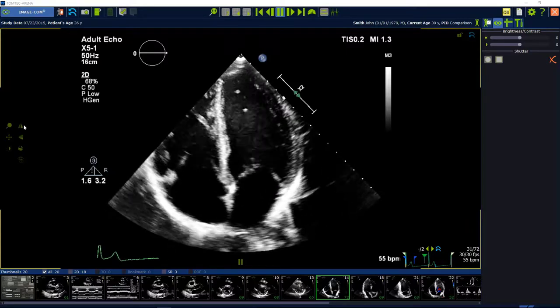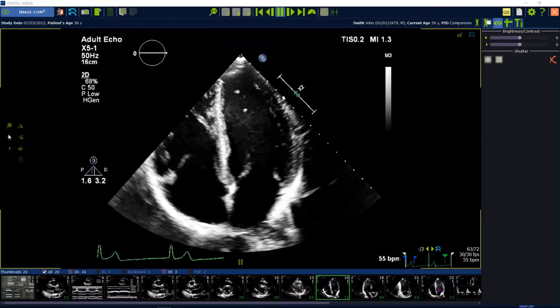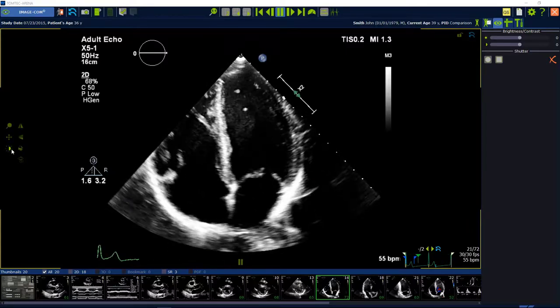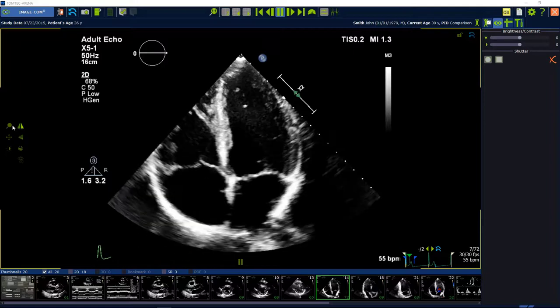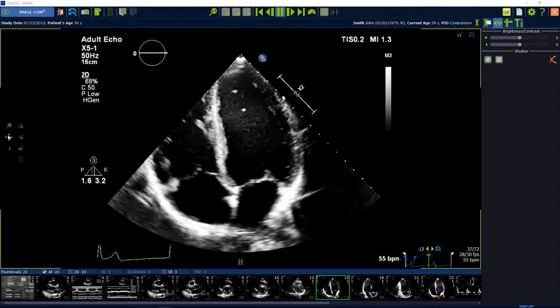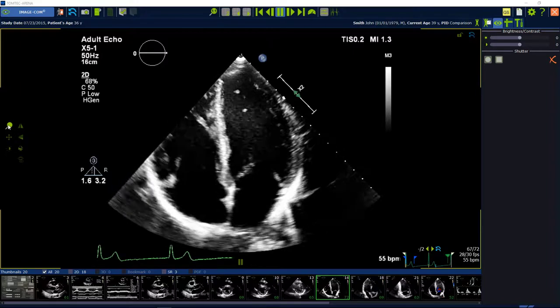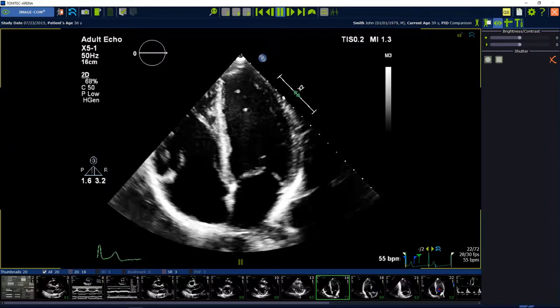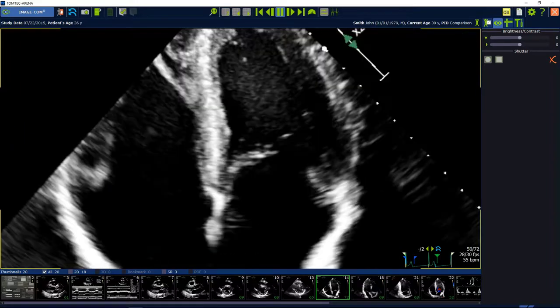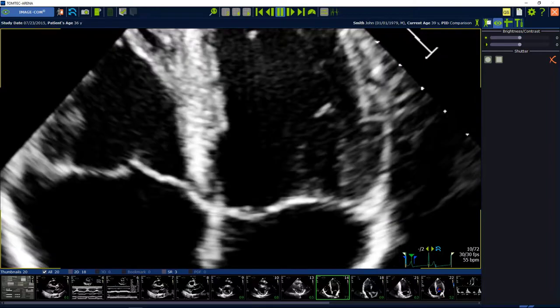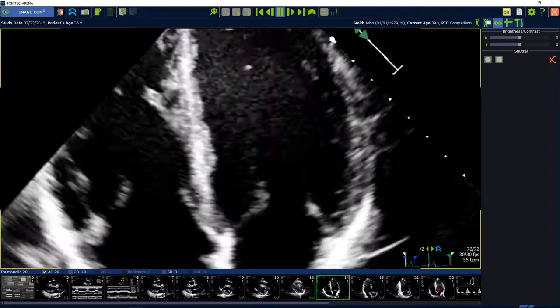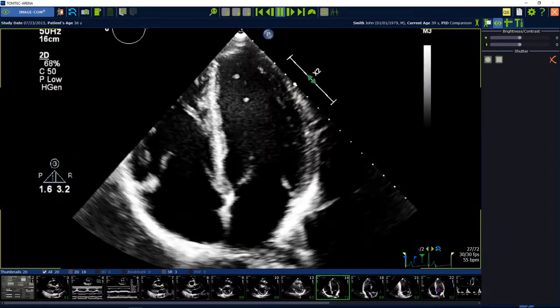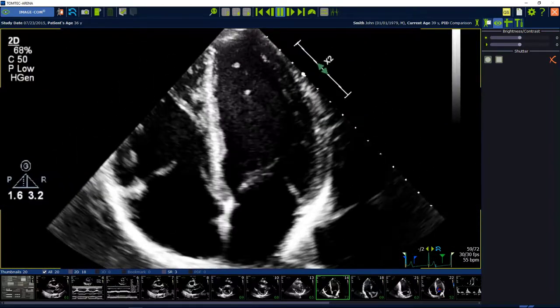The icons of the correspondent functions are visible by positioning the mouse cursor over them. The first smart region zooms into an image. Keep the left mouse button pressed and move the mouse to perform the selected functionality.